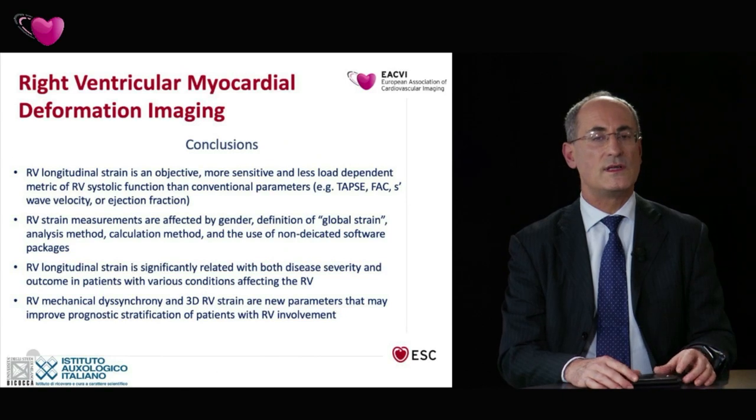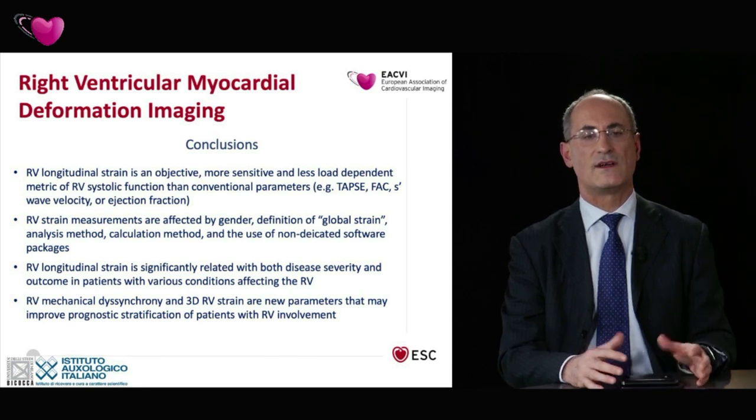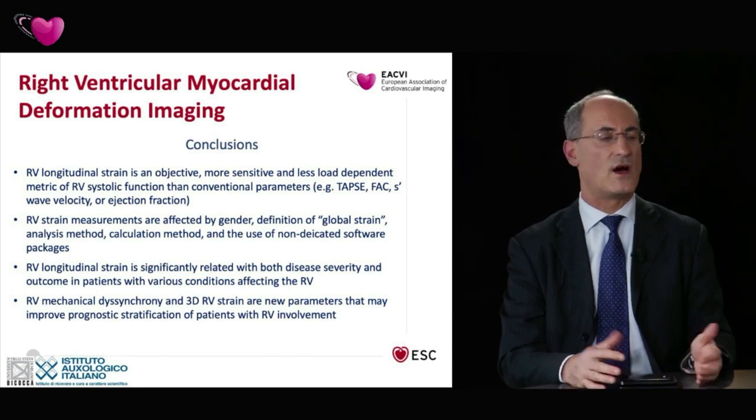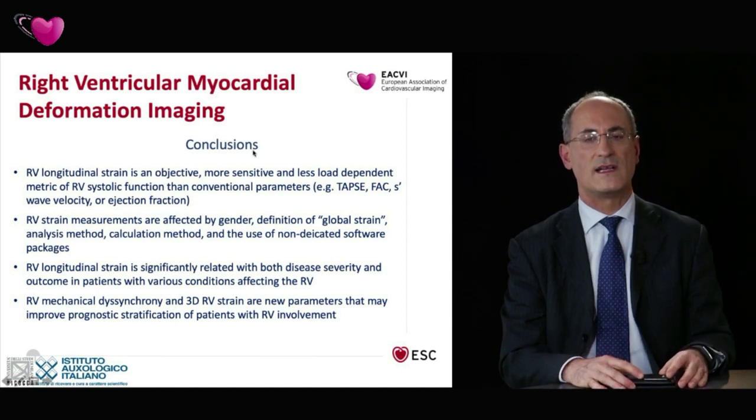Then to conclude, with a few comments that I hope I have been able to share with you: the right ventricular longitudinal strain is an objective, sensitive, and less load-dependent metric of right ventricular function.